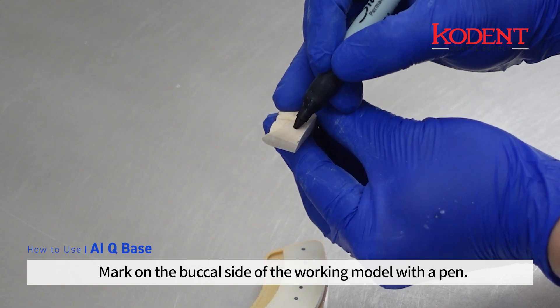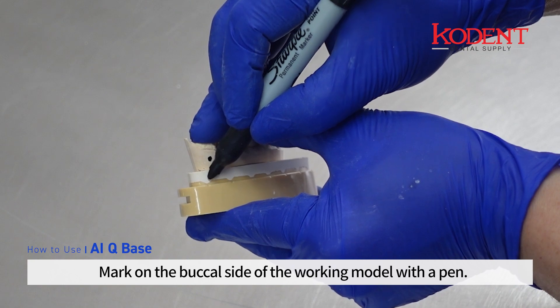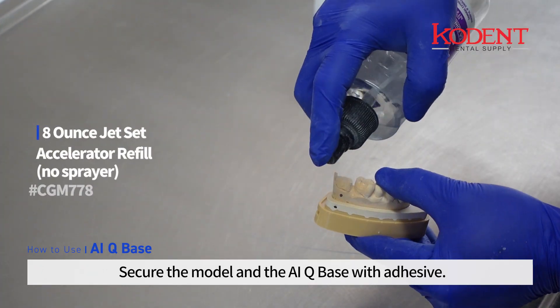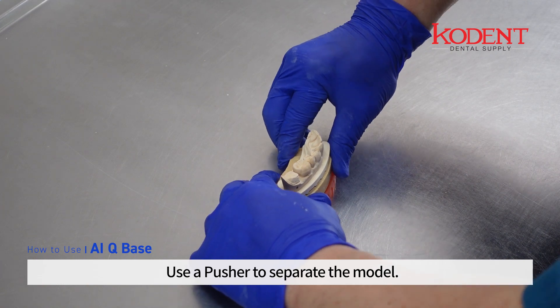Mark the buccal side of the working model with a pen. Secure the model and the AIQ base with adhesive, then use a pusher to separate the model.